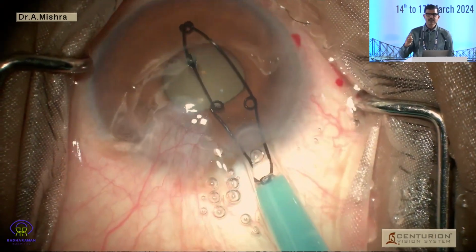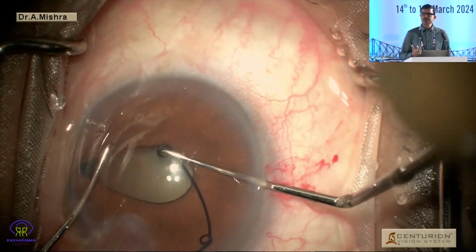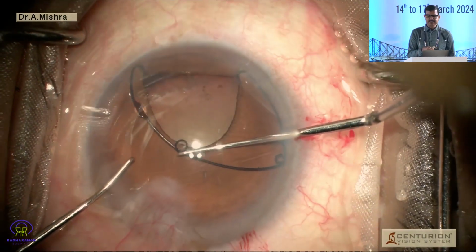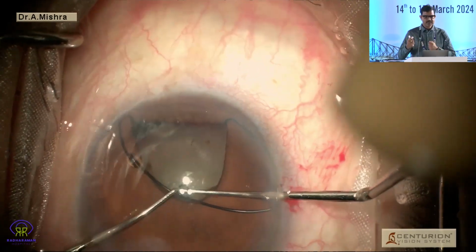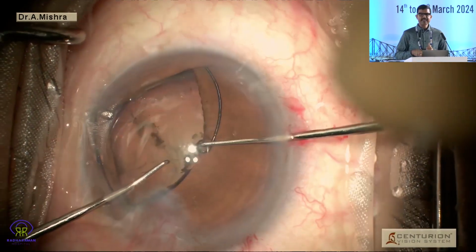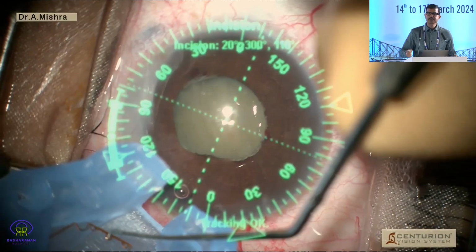The only difference with this is you need a 2.8 millimeter section for this device to go in. It doesn't go through a 2.2. And then the other thing is, it has a joint in one of the flanges. You can see that on the left-hand side, and that joint sometimes just snaps open. So just have to be careful. And it's not as malleable as a Milligan, so engaging it is slightly more difficult, but it does the job and is more economical when the price point comes in.